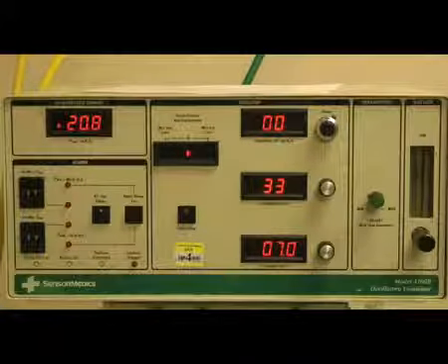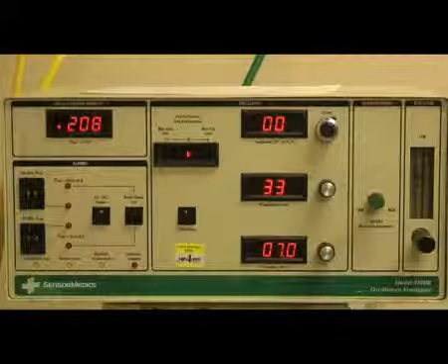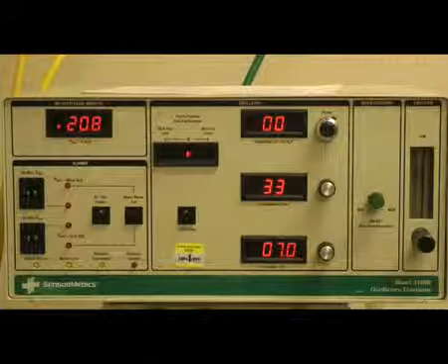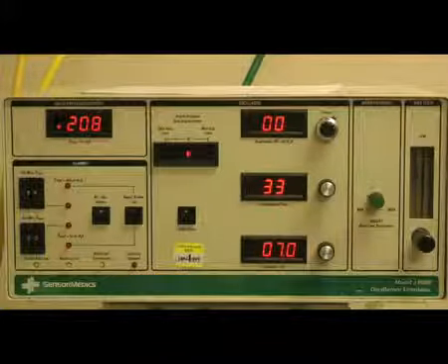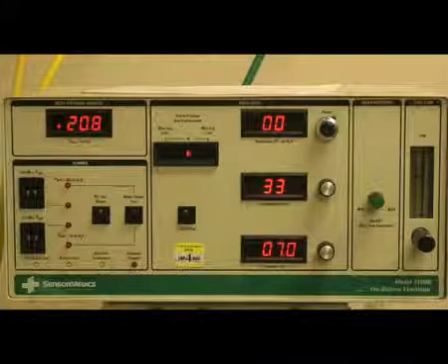Before beginning your initial recruitment maneuver, you'll want to ensure that your patient has adequate vascular volume. This means looking at the patient's fluid status and ensuring that they have received enough fluid volume for their heart to support the increase in intrathoracic pressure as a result of a recruitment maneuver.